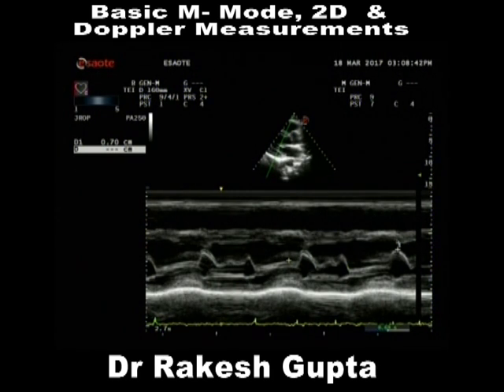Where does the heart enlarge? Which part of the heart enlarges? This is apex, this is base, and this expands. Has this ever expanded? No, this has never expanded, only this expands. Belly. So, this is the belly of the heart. So, if this point goes up, LV appears dilated with poor ejection fraction. Prashar sir will show a slide where, based on EPSS, you can say how much the ejection fraction is.